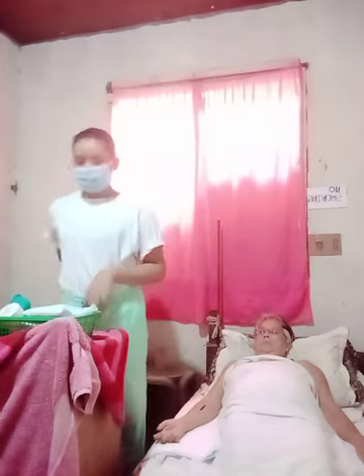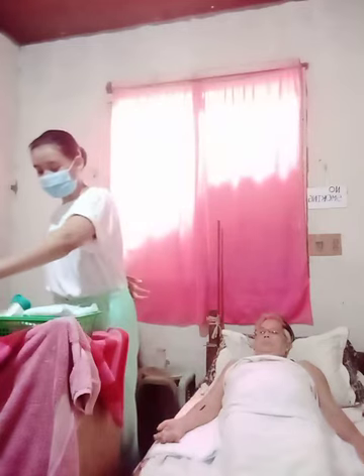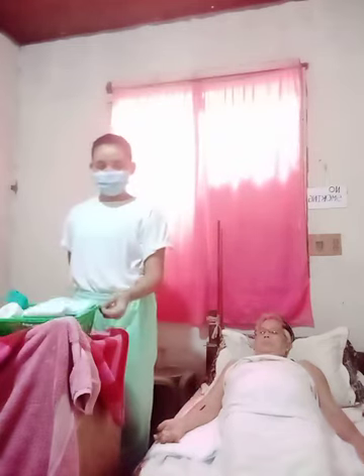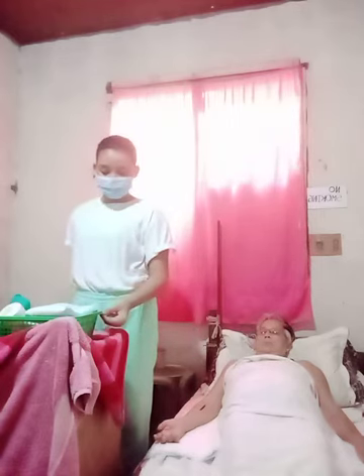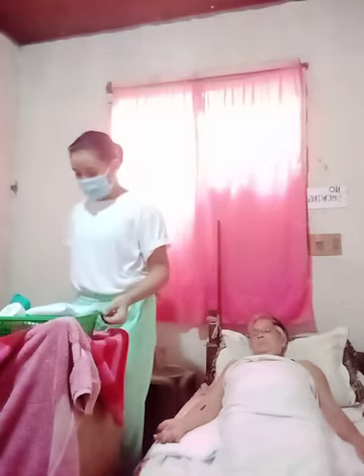Carefully, you're going to touch the end of this tray because it has a 1 centimeter non-sterile border, so you can touch it.